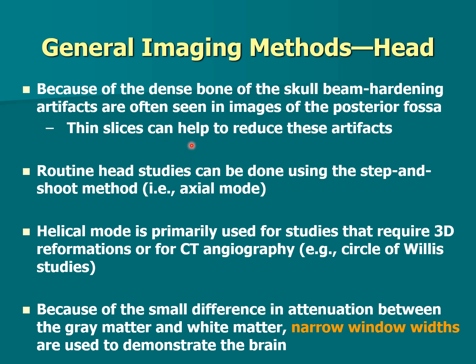Because of the density of the skull, of the bones in the head, especially the petrous ridge, it is very dense and right up against very soft tissue. If you've ever seen a real brain or touched a brain, it's kind of like gelatinous. And so you have a very dense object with a very not dense object in the middle. So we have beam hardening artifacts. We have talked about beam hardening artifacts in a previous chapter. That just means we get these streakings because we got disruption of the signal, because you're going through a very dense object to a very not dense object. Because of these dense bone structures, you get beam hardening artifacts.